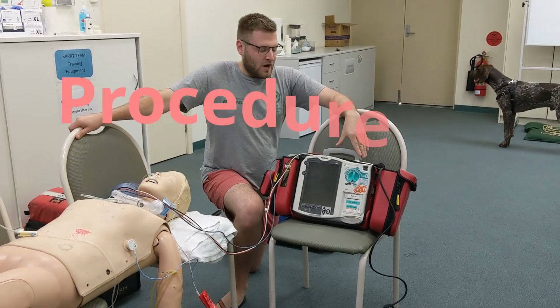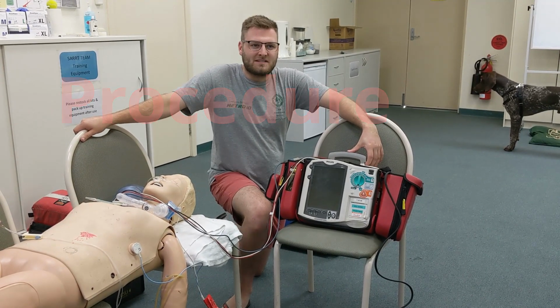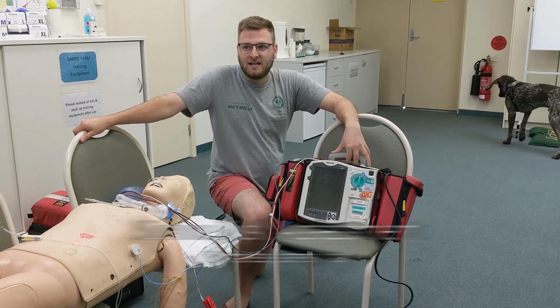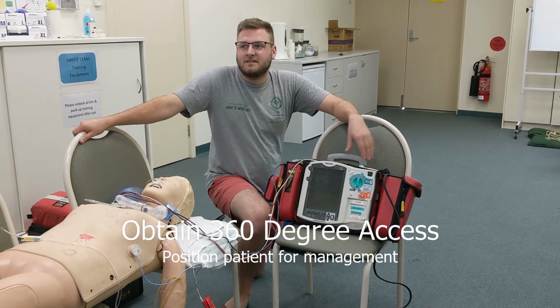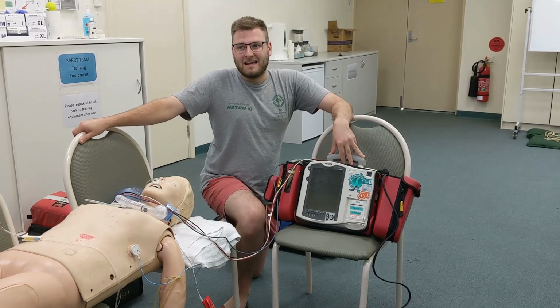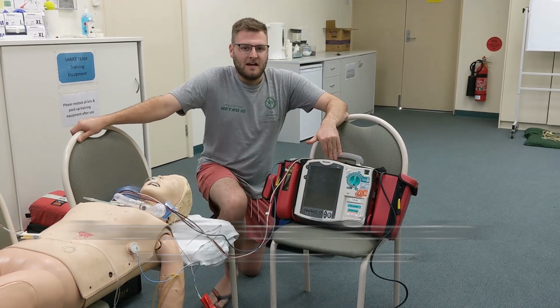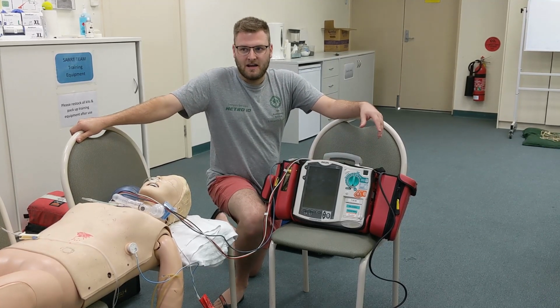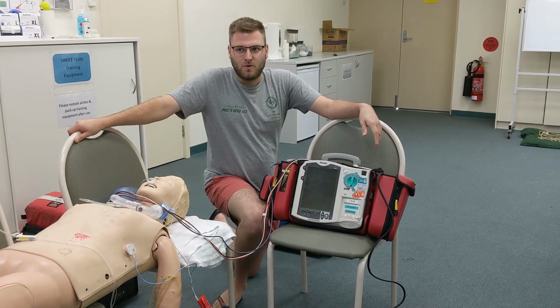Looking at the procedure of how we go about it, we are obviously going to complete our normal scene risk assessment and safety plan for the patient and staff. Going to get that lovely 360-degree access like we normally do, and have the patient in a position that we can manage them easily. Be prepared to support the patient's ABCs, make sure that they've got a patent airway, that you have your airway equipment nearby, and that you have oxygen nearby as well.